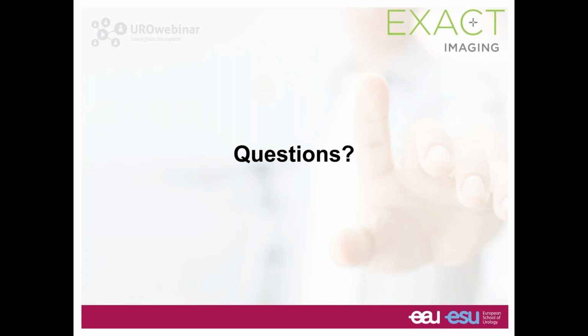The next question is, what is the current status of transrectal ultrasound elastography? The current status of transrectal ultrasound elastography is basically just linked to the technology, and it depends on what kind of technique you use, strain elastography or shear wave elastography.